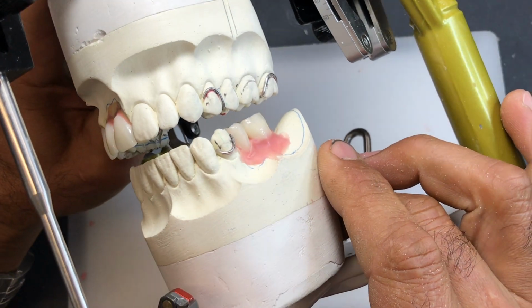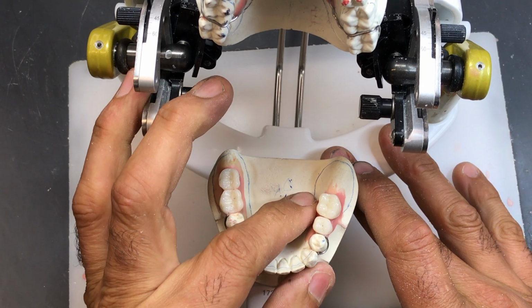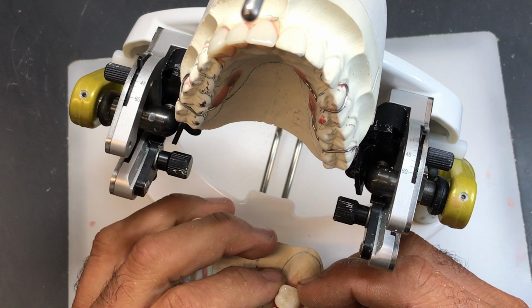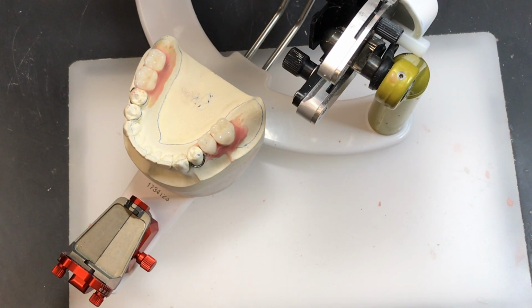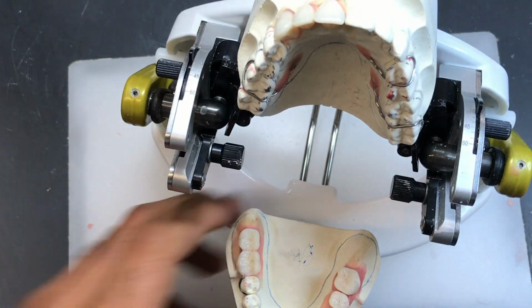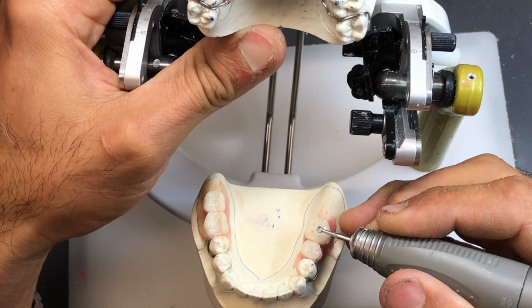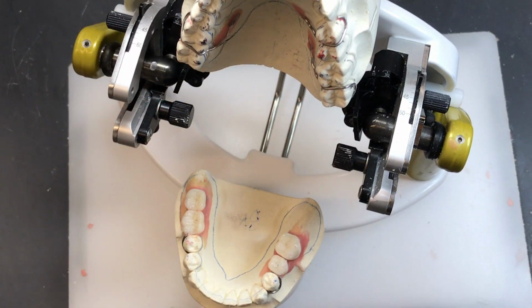Okay. So I'm just going to let that chill just a little bit more. Make sure that the wax is nice and hard to support the tooth. Again, make sure that you don't have open contact areas between the teeth. Everything is nice and tight. And gently, once more, let's use our articulating paper and see. There we go. I got a little bit of an imprint right here. So we're going to do some selective grinding here and there. Just do it in small increments.